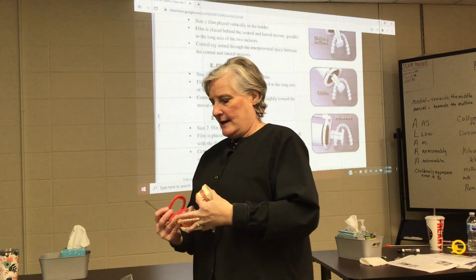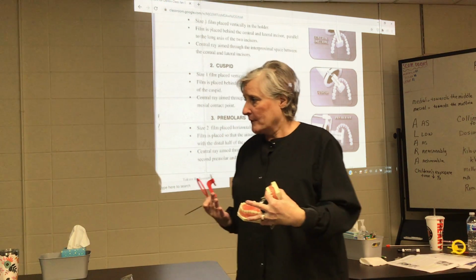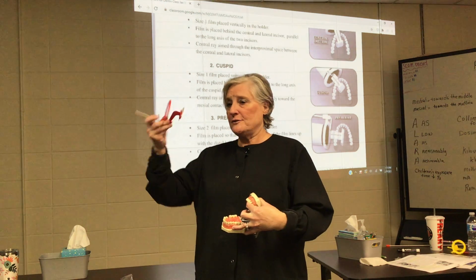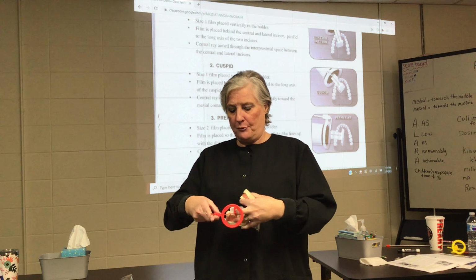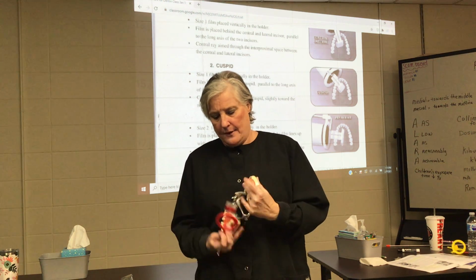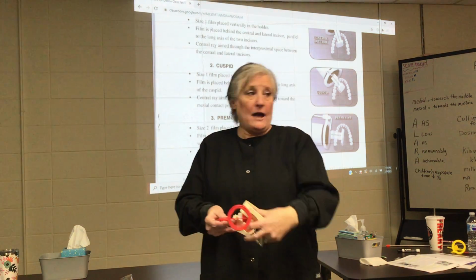bite wing. Then, rather than going back to the molar and doing the molar and premolar, on this one, we're gonna do what I call roundhouse. Okay, so we're gonna do molar, premolar, premolar, molar. So we're gonna jump over here to this side. All you have to do is turn it over like you do with the blue one, the anteriors. So we're gonna take premolar, using what tooth as the guide? Distal of the canine. And then we're gonna go back and take the molars. Okay? Perfect. See how that's done?